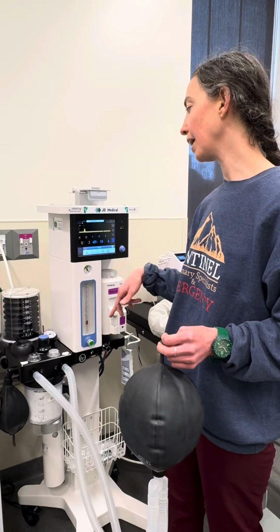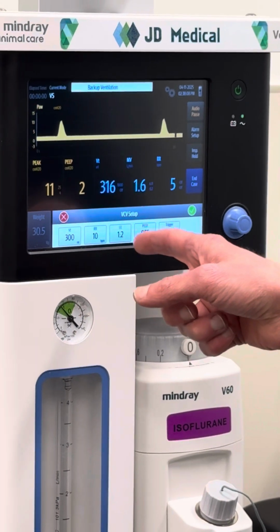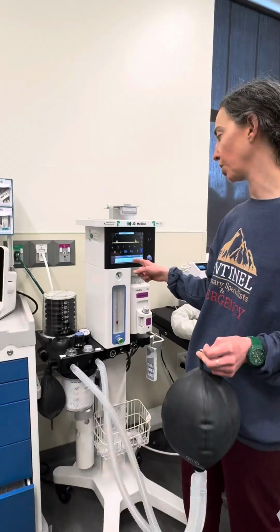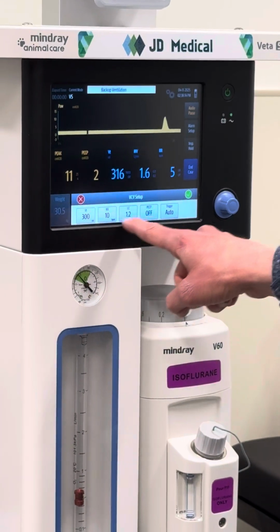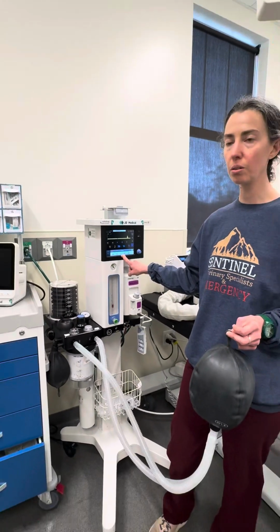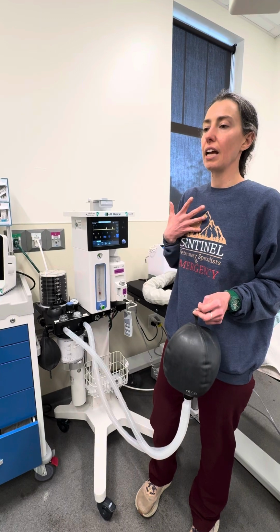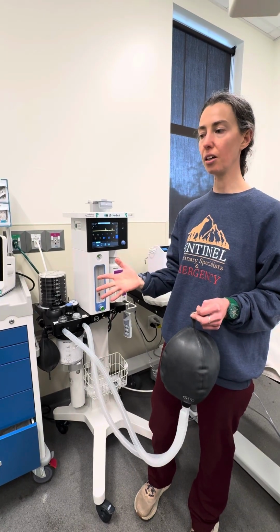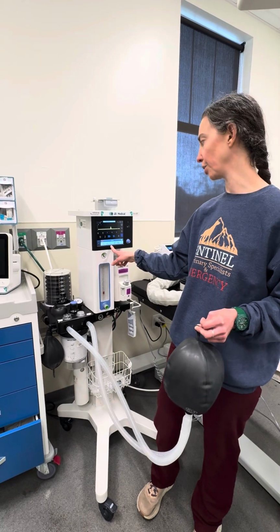But what I recommend you put all patients on is the VCV ventilation, which is volume control ventilation. So you have your tidal volume, you have your respiratory rate, you have your I to E ratio, which is going to be preset at 1:2. And that's inspiratory time, how long it takes to inhale versus how long it takes to exhale. That's an I to E ratio, and we want that to be about 1:2.